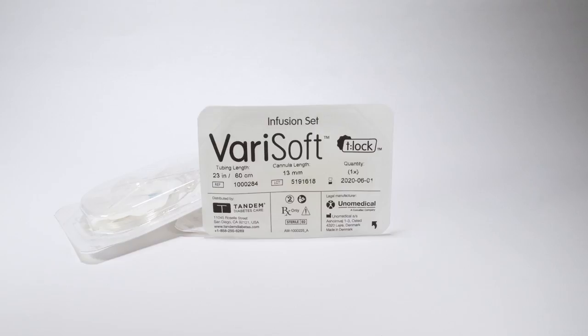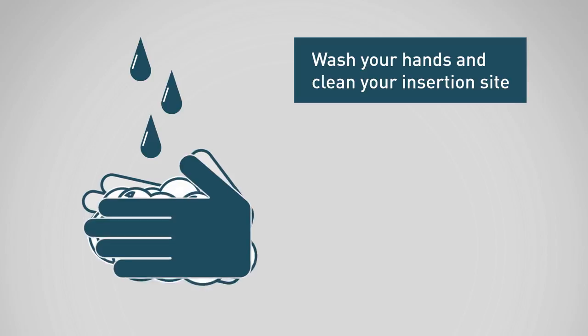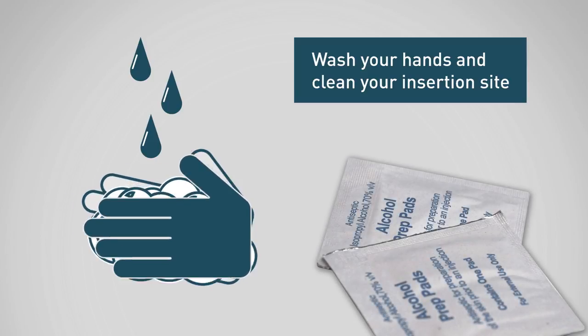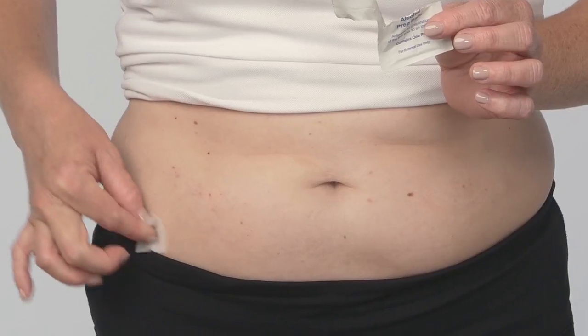How to use the VariSoft Infusion Set. To begin, you will want to work on a clean surface. Be sure to wash your hands and clean your insertion site. Please refer to your health care provider's recommendations when selecting an insertion site.